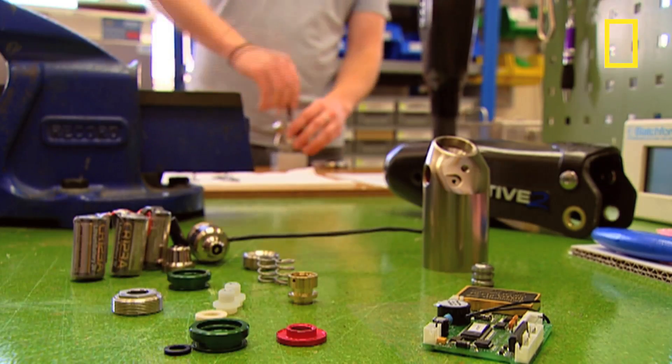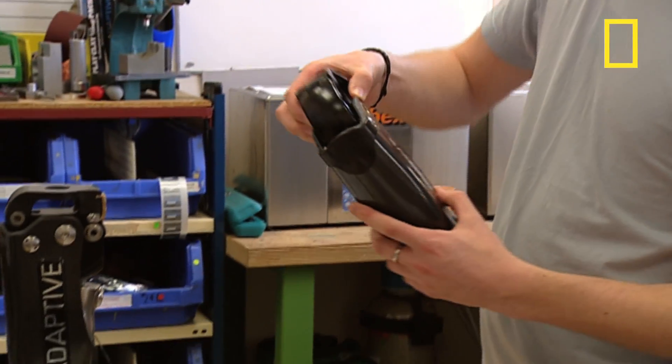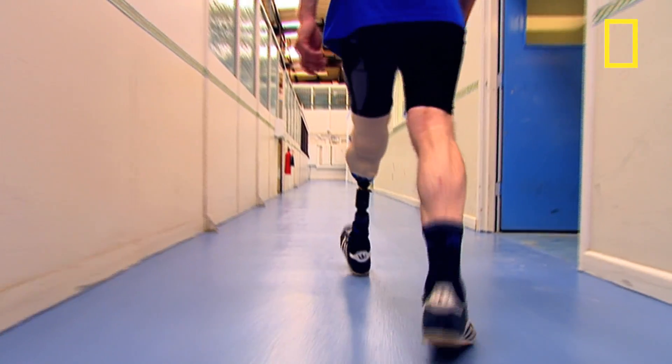If the limb is designed for very active use, then the design is incredibly complex. This top-of-the-range knee will take two days to build and contains hydraulics, brakes, microchips and even miniature motors. They all make the action and reaction of the joint as natural and stable as possible.